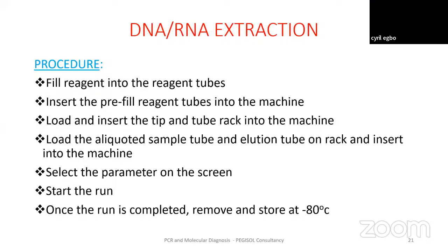For instance, GeneXpert is one of them, as an example. Then we currently have Abbott machines that are used for viral loads. Then we have Roche machines that equally do this. Then I think some Cobas can actually do the same.